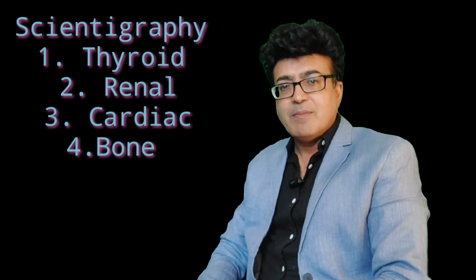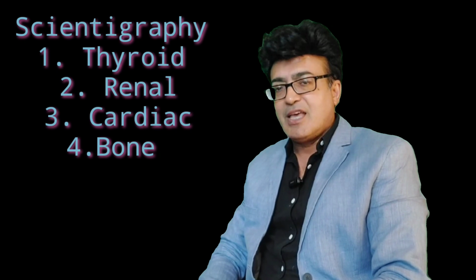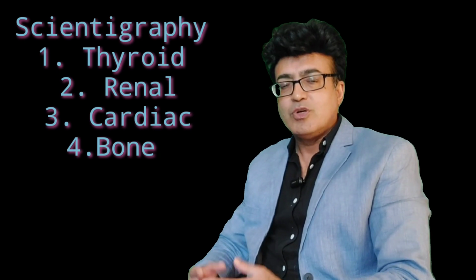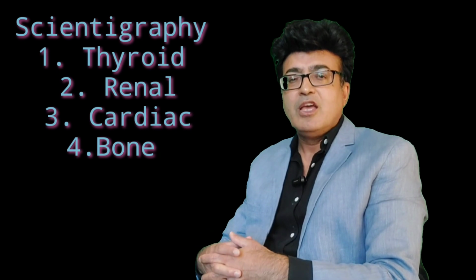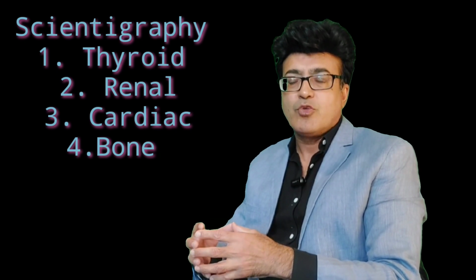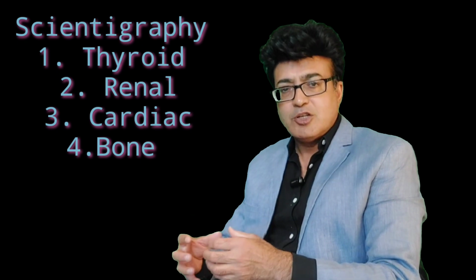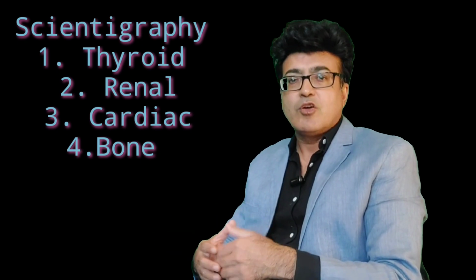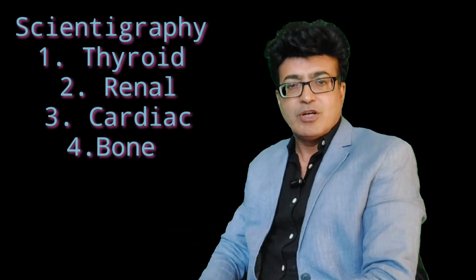As far as cardiac imaging is concerned, the MIBI scan can also be used. For the bone, as I have already discussed, the bone scan is used to detect metastasis. So in short, scintigraphy or nuclear medicine is an integral part of diagnostic radiology, and you can depend on it for the detection of all these points which I have already mentioned.